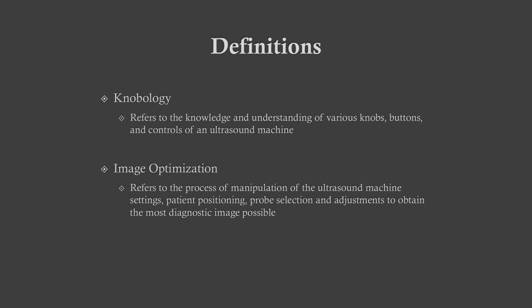Before diving into the subject of knobology, let's go over some definitions. What is knobology? It refers to the knowledge and understanding of various knobs, buttons, and controls of an ultrasound machine. Another important term that we will refer to a lot is image optimization. Image optimization refers to the process of manipulation of the ultrasound machine settings, patient positioning, probe selection, and adjustments to obtain the most diagnostic image possible.